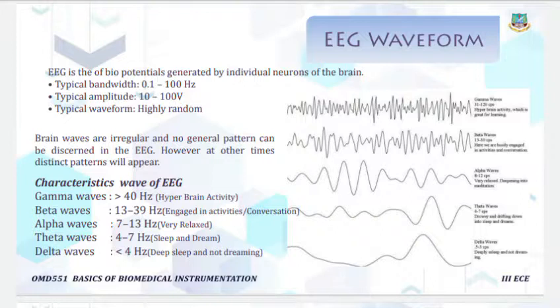Normally it happens when some anesthesia is given. The frequency of the delta wave is less than 4 Hz.